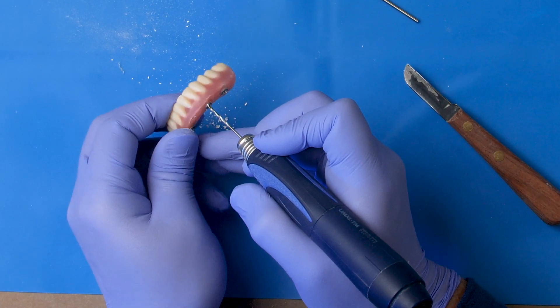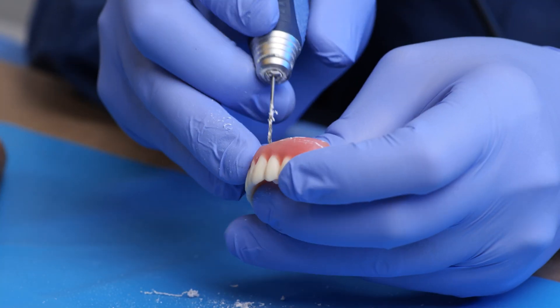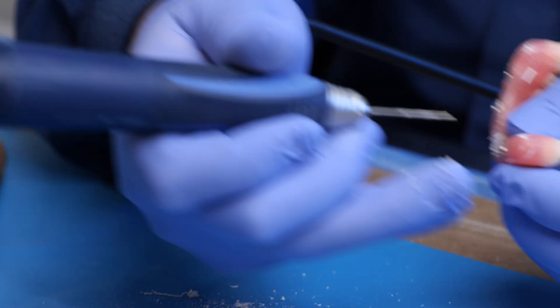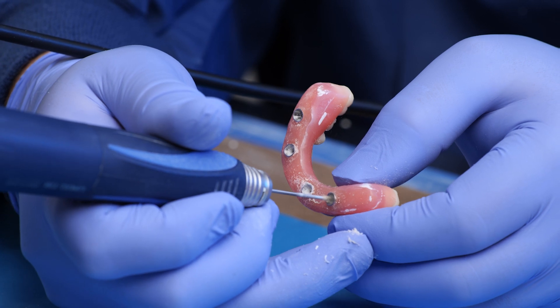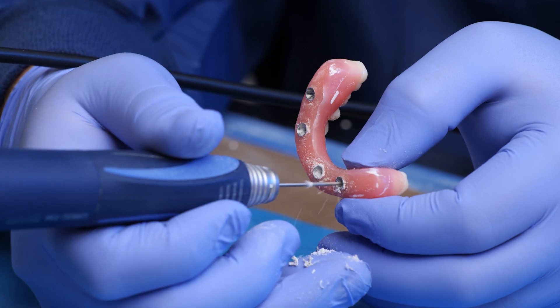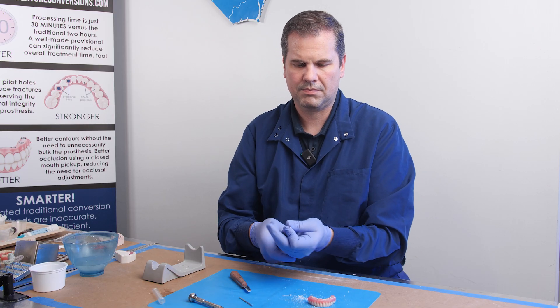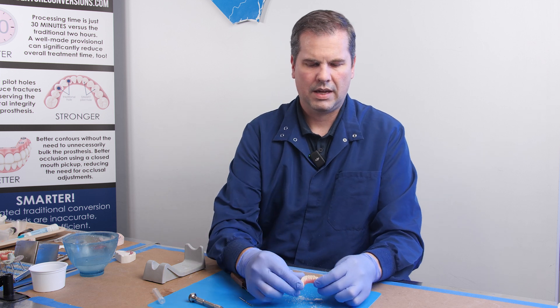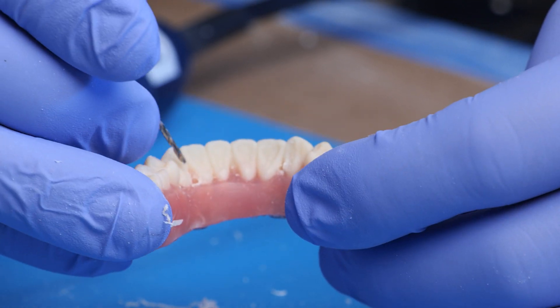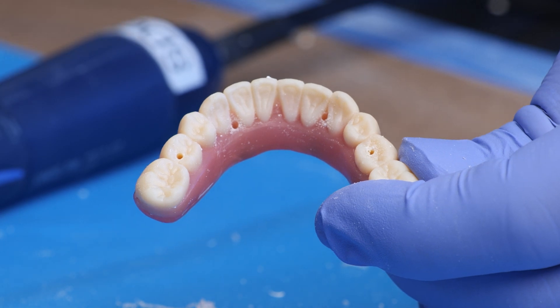We'll do this three more times — there's the second one, the third one, and then the fourth one. That's all it takes to do the pilot drill. Now if you look, you can see four very, very small holes directly in line with those tie bases.